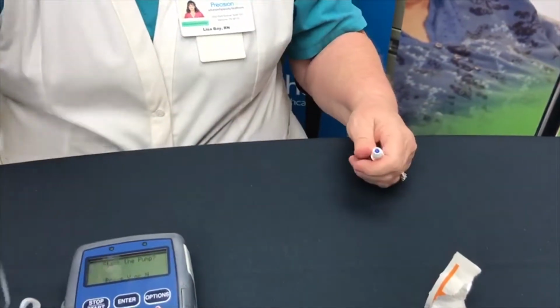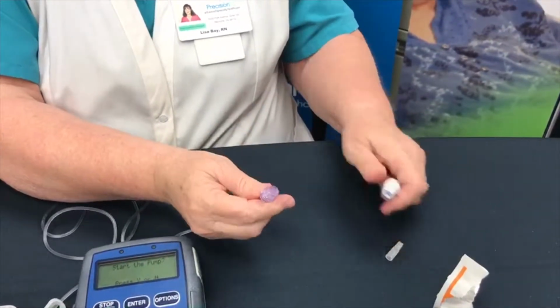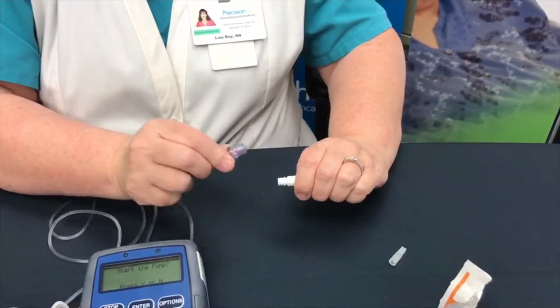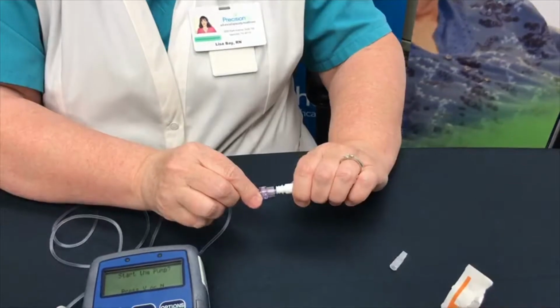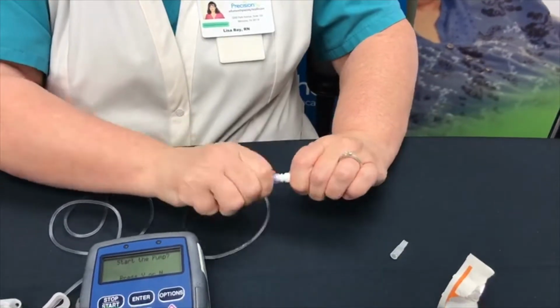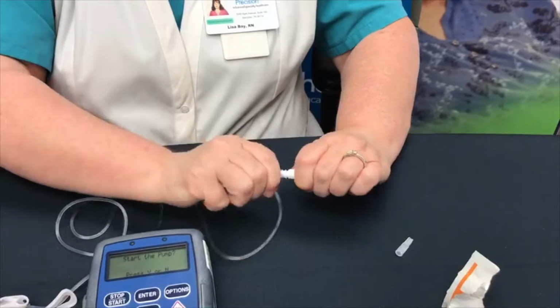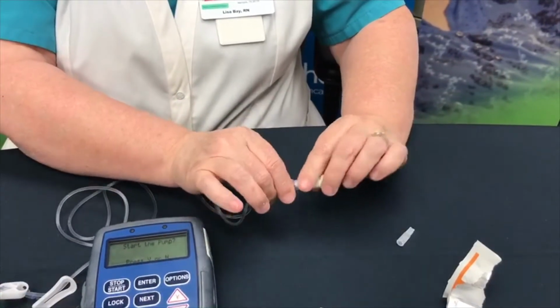Then we're going to pick up the end of our tubing, take the protective cap off, and attach this to our pump. We're going to attach the IV tubing to our hub by pressing it in. There's a little spongy part in the center. Press in and turn to the right. So you're going to press in and turn to the right. Make sure it's snugly attached so that it doesn't leak.